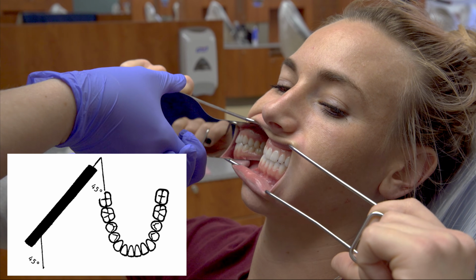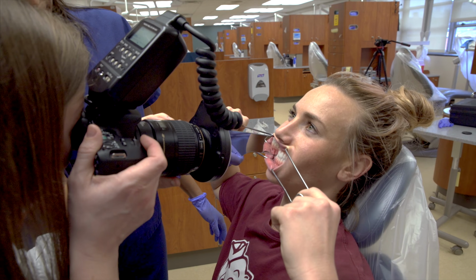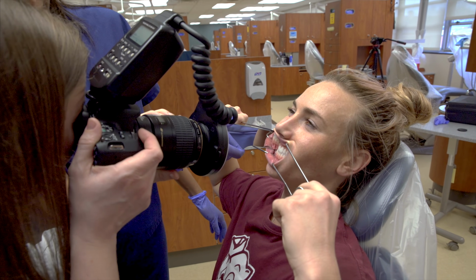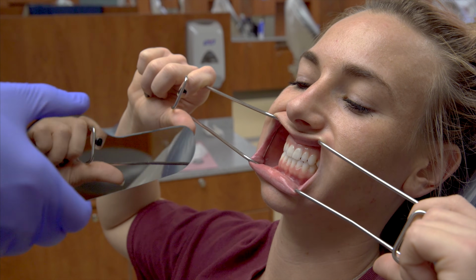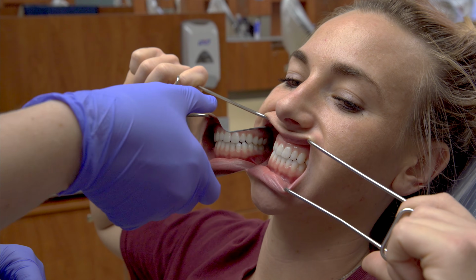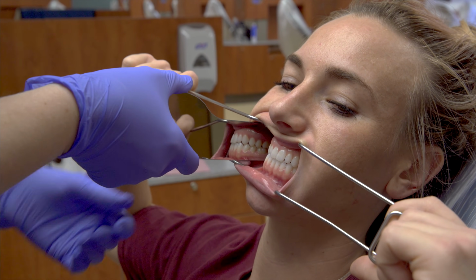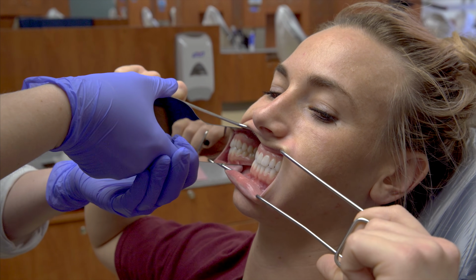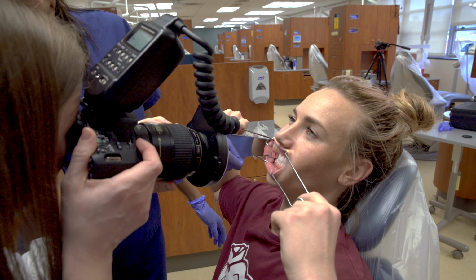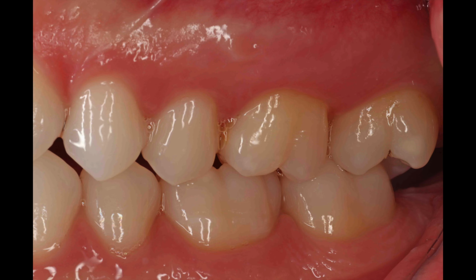The photographer will then take the photograph at a 45-degree angle to the mirror, creating an ideal 90-degree angle to the teeth. Once the assistant places the mirror at 45 degrees, she will then move the mirror buccally, making sure to maintain the same angle and ensuring the mirror is not resting on the alveolar ridge. That movement is often quite uncomfortable for the patients, so we always recommend that the photographer get set up and ready to take the photo prior to moving the mirror buccally.